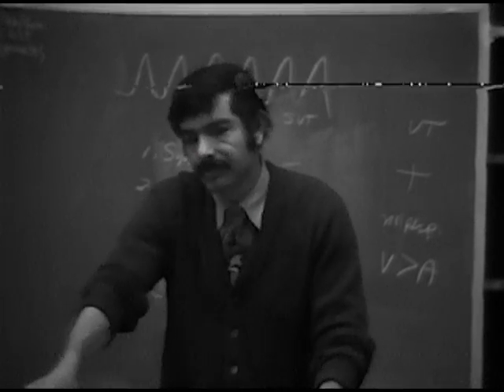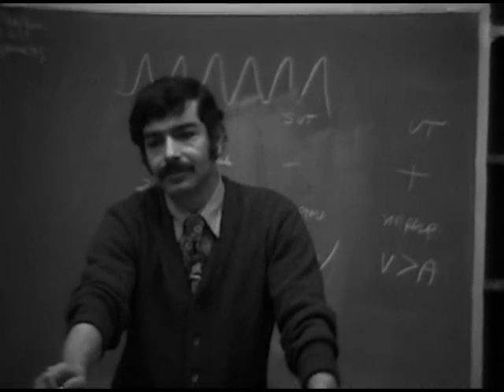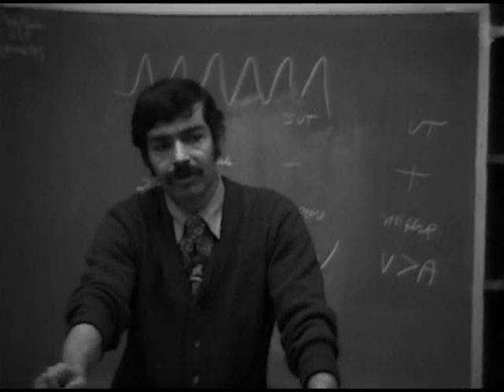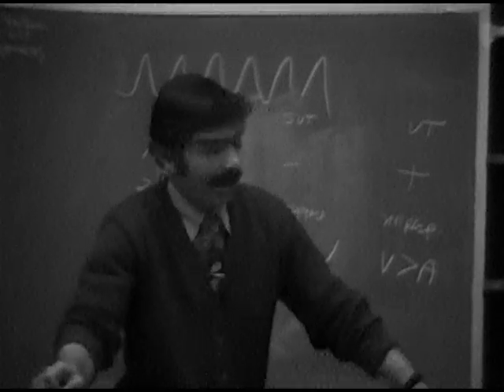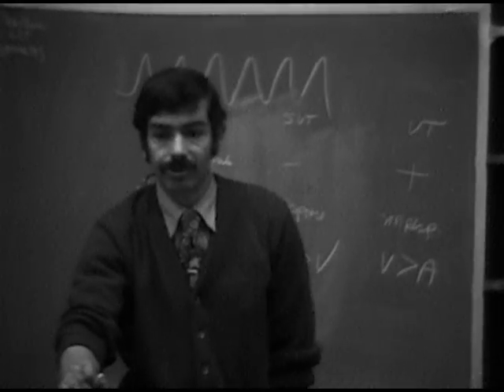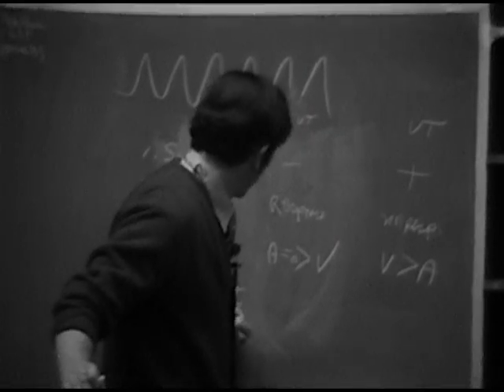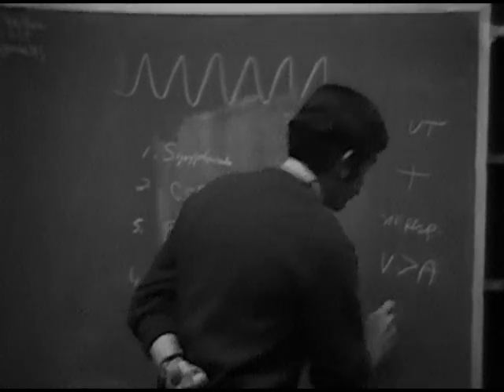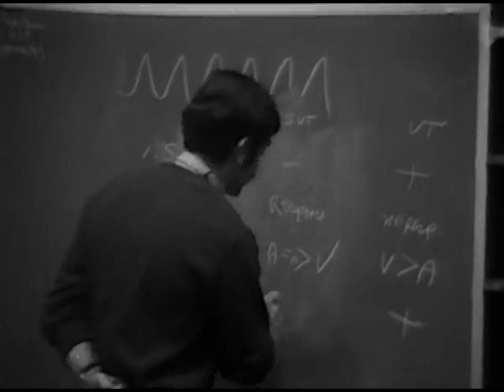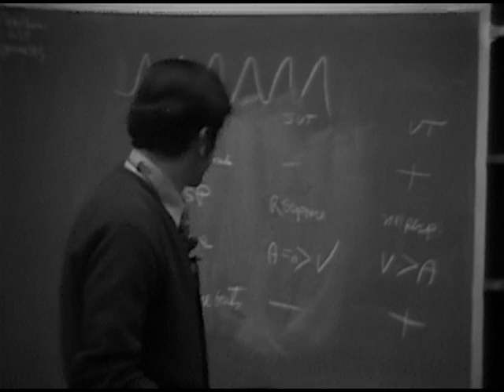Some conduction is occurring, and so you have AV dissociation. And AV dissociation, when you're trying to differentiate these two, generally means ventricular tachycardia in this setting. So the presence of capture beats implies ventricular tachycardia.